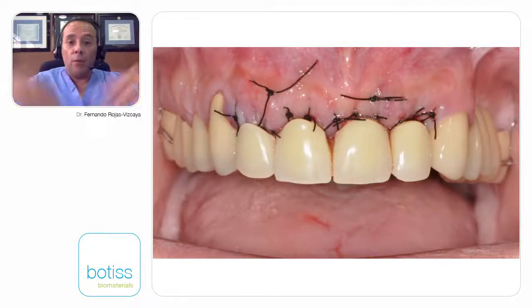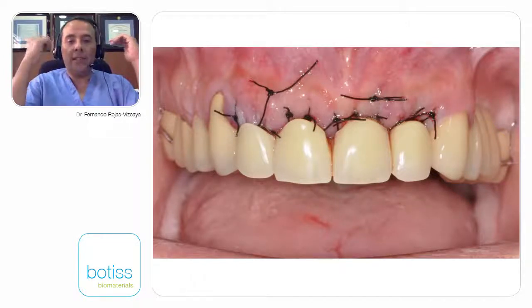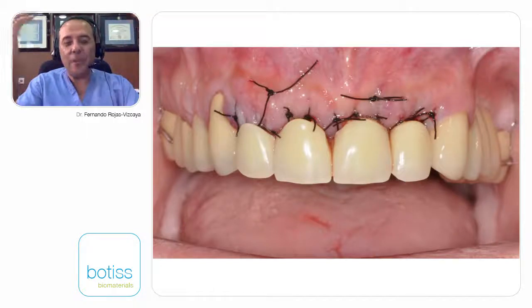Later you will see that our plan, because the incisal edge and the margin for the two central and lateral are okay, we are planning to move the margin of the crown in more apical direction to match with the right canine of the patient, not too much at the same level, to find the harmony with this canine.